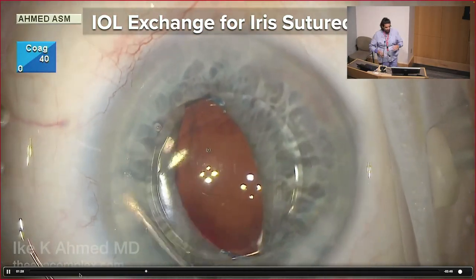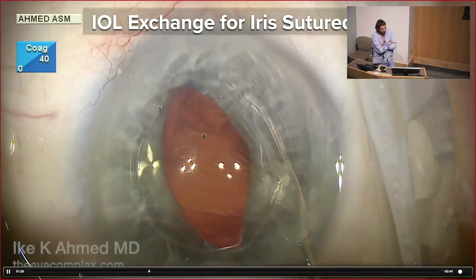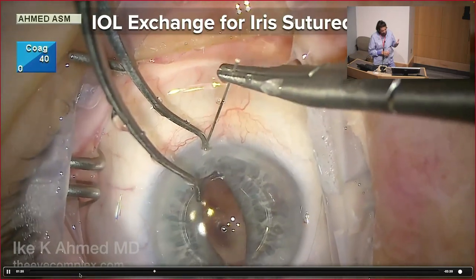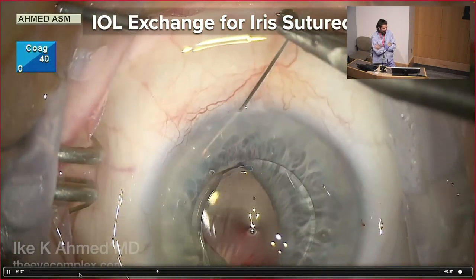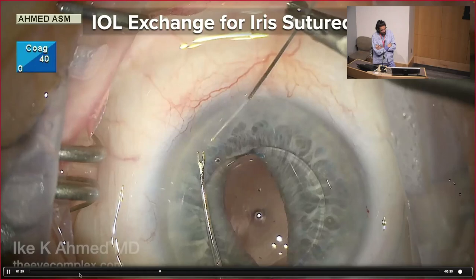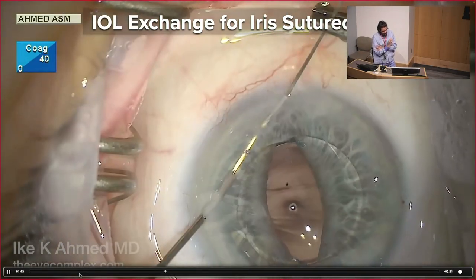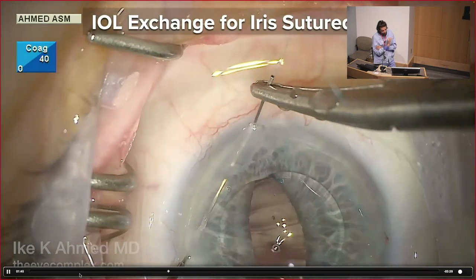I don't think we let go yet. Well, I did let go. We very carefully want to manipulate things as well. And again, be careful not to overpressurize the eye. Too much OVD in the eye could end up causing the pupil to dilate and the lens to drop. Suture position should be placed in the mid-peripheral iris, not near the pupil. Take as small a bite as you can. This is a CIF-4 needle on a Prolene.